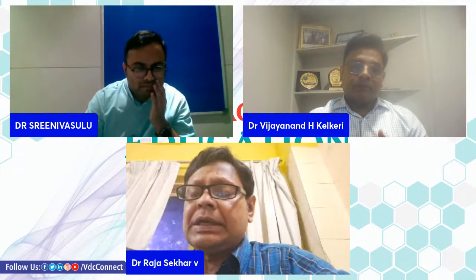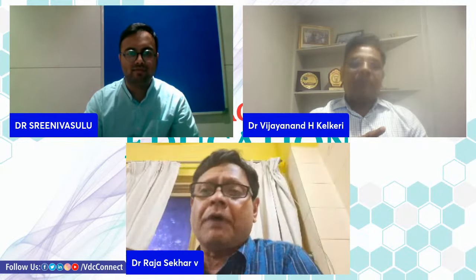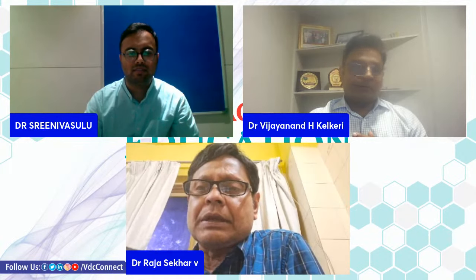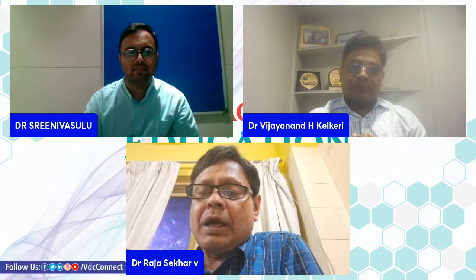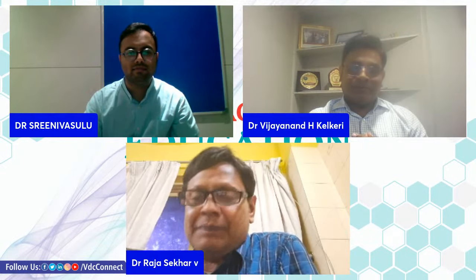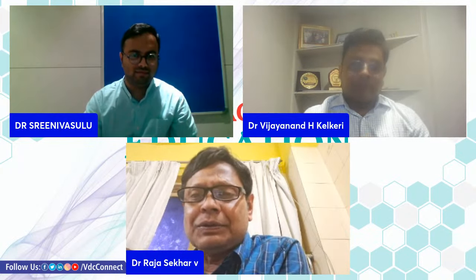And one more thing, the 3D reconstruction of the CT foot is really helpful in designing and planning my osteotomy to correct the foot deformity. Nowadays, in Apollo, we are doing Charcot's reconstructions. Dr. Venu comes from King's College, London University, once in 3 months. We made 3D reconstructions, sometimes the physical model. The physical model really helps after the 3D reconstruction from the CT report. We are doing the physical model in some cases. It improves our accuracy in surgery.